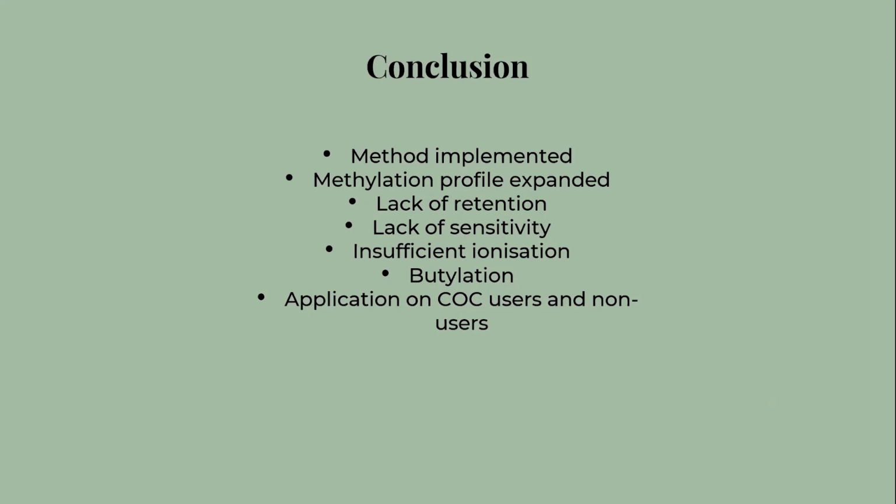The successful development and validation of a targeted method can help us better understand the improvement we see in the methylation of catechol estrogens and help us understand if combined oral contraceptives have influence on the effectiveness of the methylation cycle.